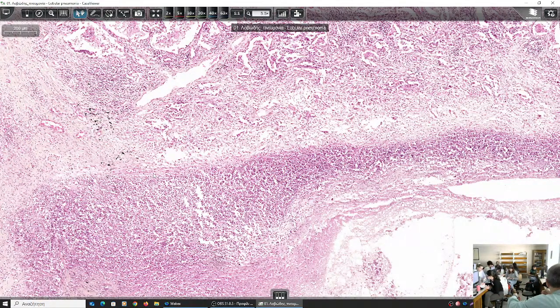What is an abscess? A cyst filled with pus. And how does the tissue help me to treat the patient now that he has an organized abscess? What is there for me to do? I give antibiotics, but no matter how I give them, either orally or injected, they reach the area with circulation, with blood. Where are the blood vessels here? Are they in the center of the abscess where the microbes were? No, they are in the outer zone. Can you show me a vessel in the outer zone of the abscess? Because that's the point where the drug will reach. It cannot reach the microbes. The microbes are in the center of the abscess.